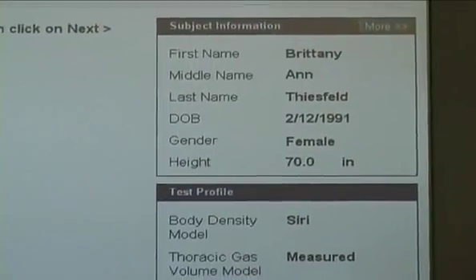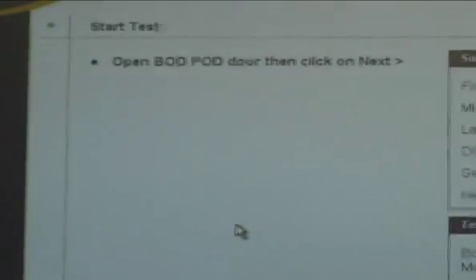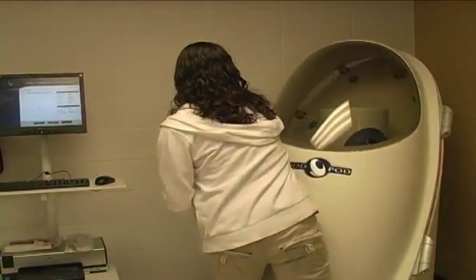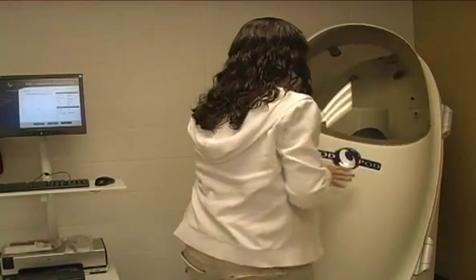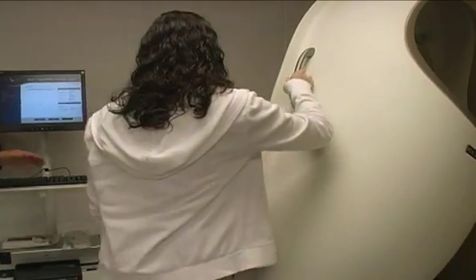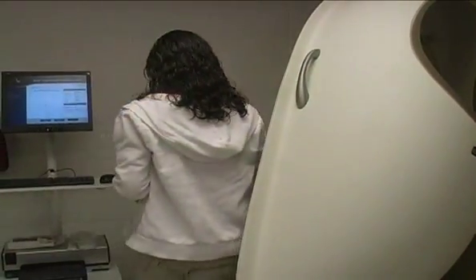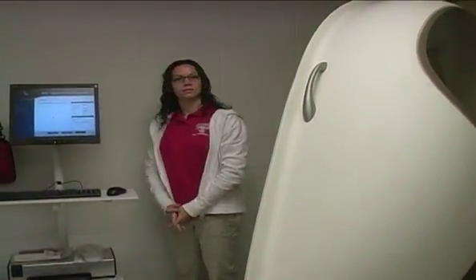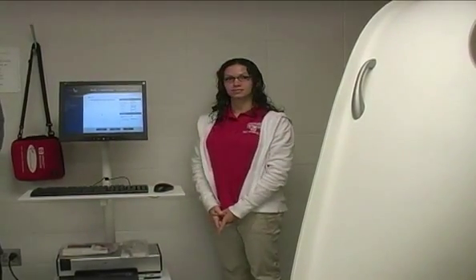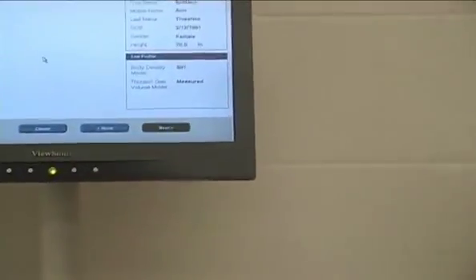So open the BOD pod door, click next. I'm going to have you do all this. And it's kind of heavy, so just open it all the way. There you go. And it was born in research, so you'll see it's very rudimentary as far as open door, next. There's a process. Then it will say closed door, next. There's a whole process with it. So if you could hit next.